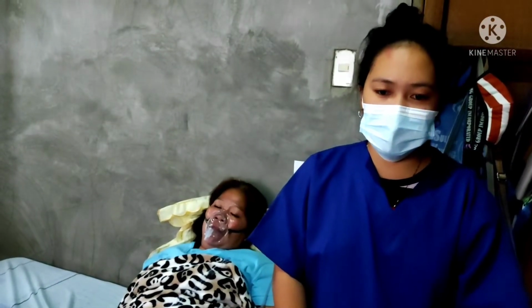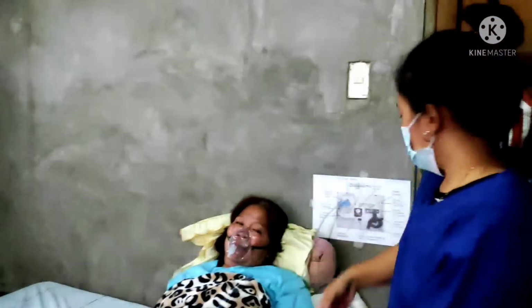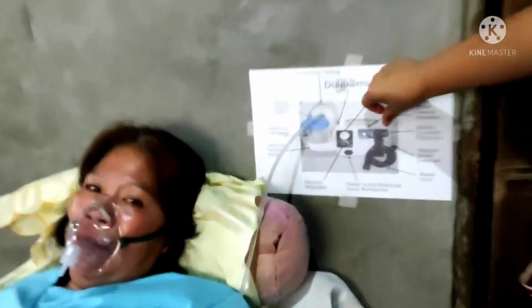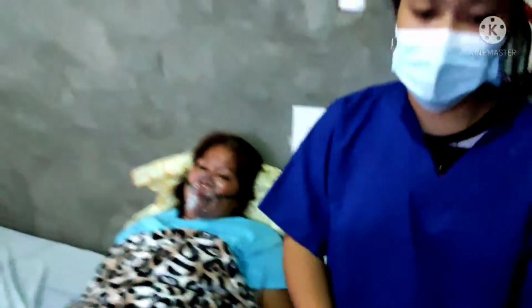Turn the suction device on and set the pressure to the lowest level possible that will effectively clear secretions. After checking the pressure by blocking the end of the tubing, place the open-ended tube near the patient within easy reach of your work area.